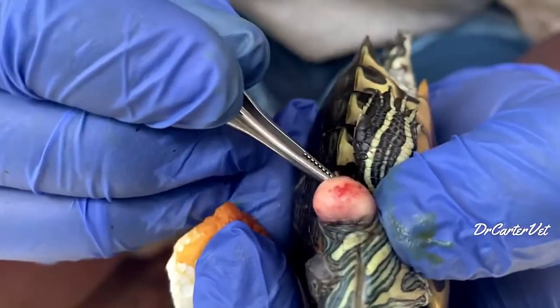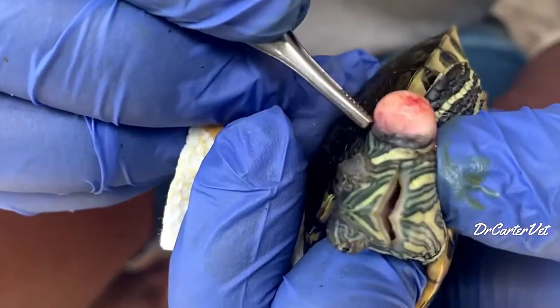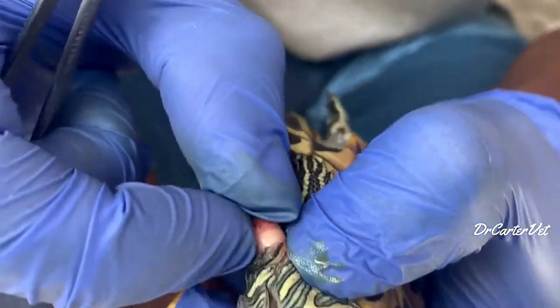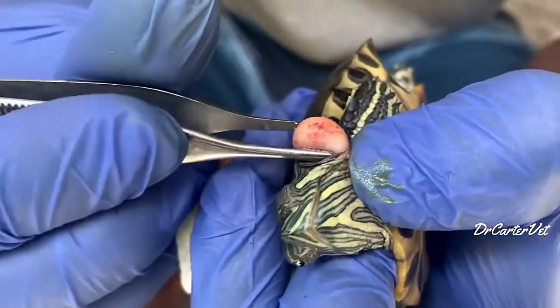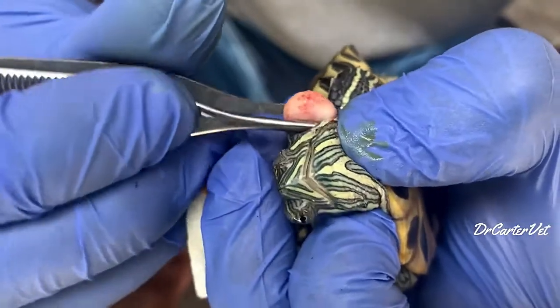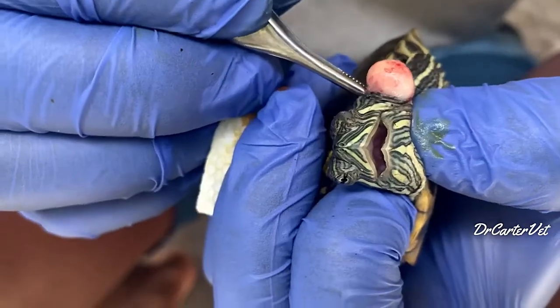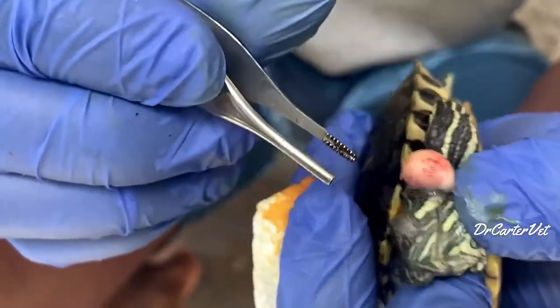It feels somewhat like you're taking a little ball off the side of its face. The best way to do this is to turn it in a clockwise or even an anti-clockwise direction. By screwing it, you get a deeper part of the root to come out. As you can see here, I maneuvered it a bit, went to the base, and freed up some of that connecting tissue to ensure I got the entire cyst out.